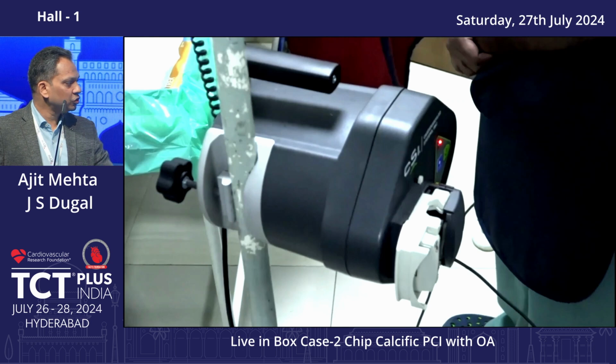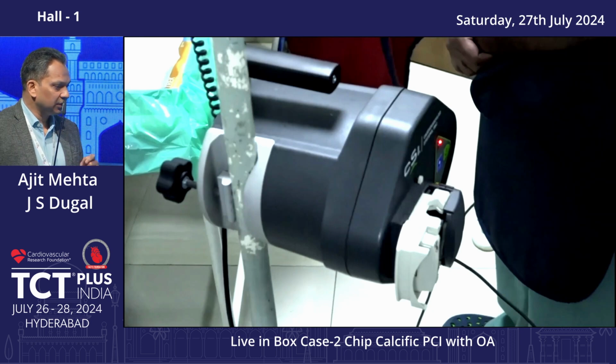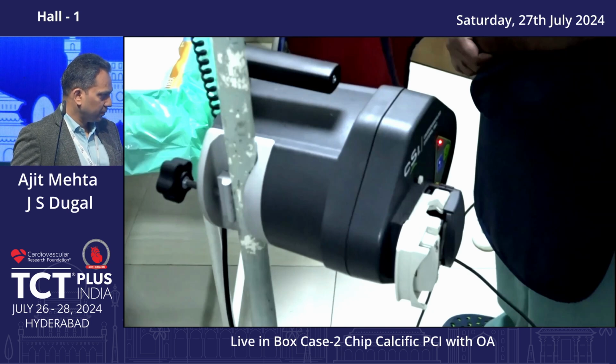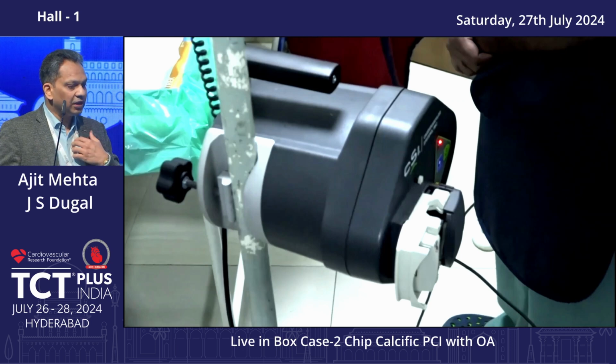Right. Do you mean to say we should do something different? In the beginning, when rotablation was new, osteal was not a lesion you actually did rotablation on. So do you want to say that if you have tight osteal disease, we should do balloon dilatation before using these devices? I would use rota in that case. If it's a tight osteal lesion and you need to get through, the balloon's not going to help you very much. So just use rota, especially for new users.